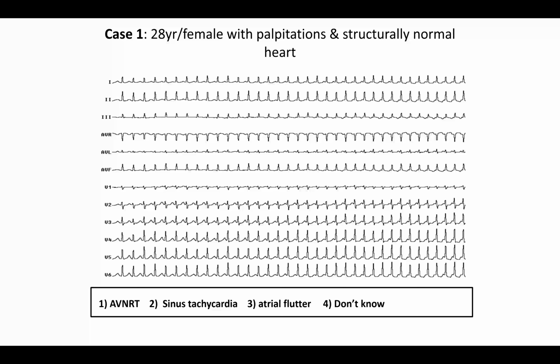That is one. Second, when you do decrement pacing and you have an HV block at baseline without any drugs, if you are trying to search for the Brady study, that means it is a high-grade AV block. That is second. Third, if you have an HV block with bundle branch block, again, the chances of high-grade AV block are there.